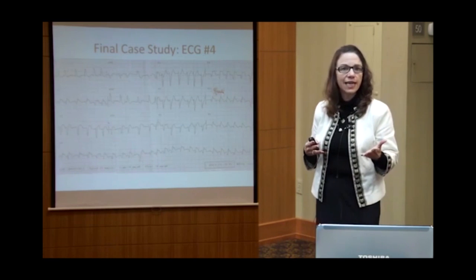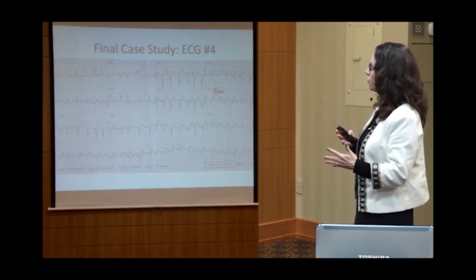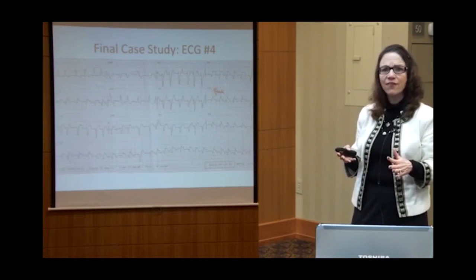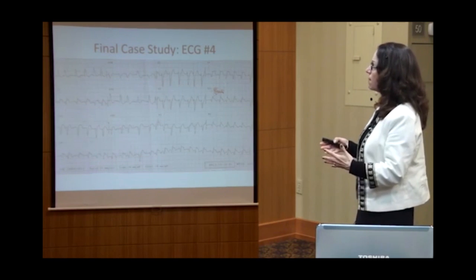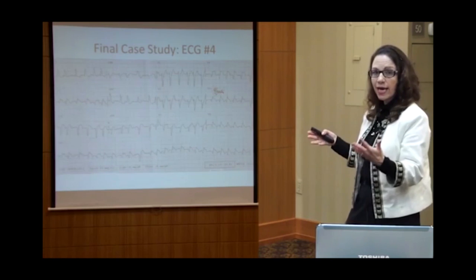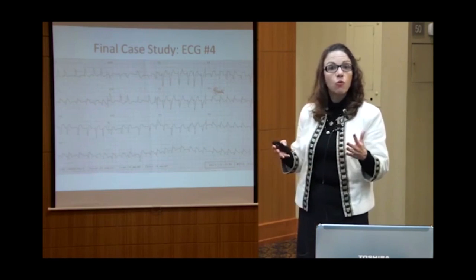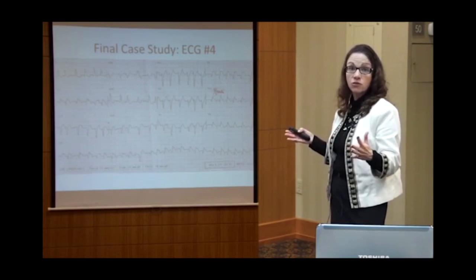Digoxin is usually contraindicated in acute MI. We let him know that. He still wanted DIG given. We gave DIG, but DIG didn't really have any great effect on him in terms of rate control. So what happened is the interventionalist came up to actually look at him and said, hey, he's not going to tolerate this. We got to get him out of this. And so what we should have done, do you not agree, is the patient should have been cardioverted electrically.